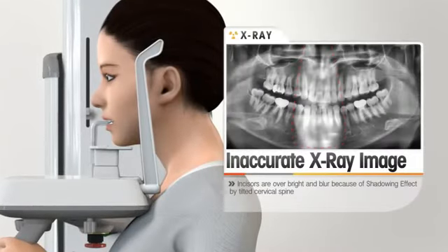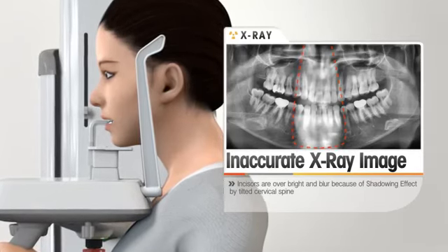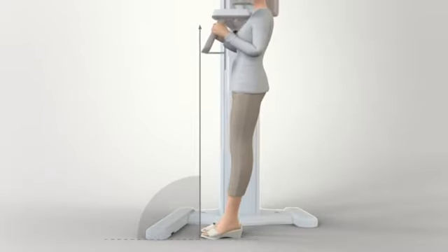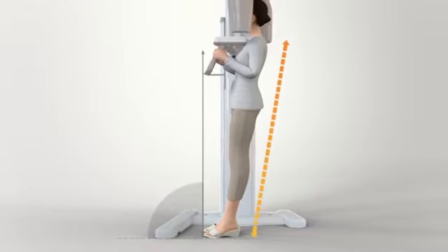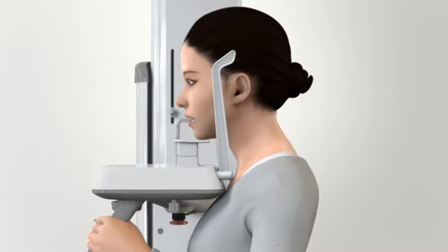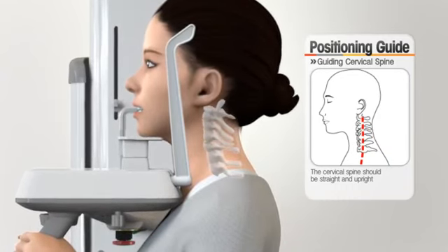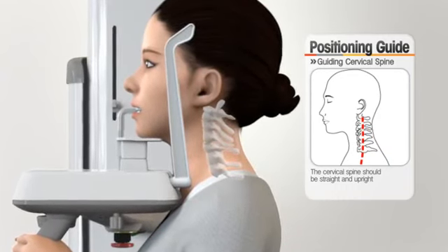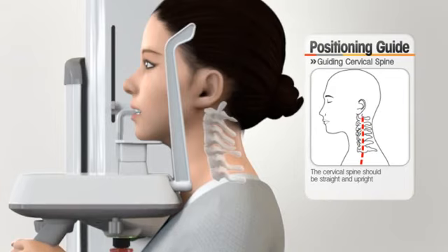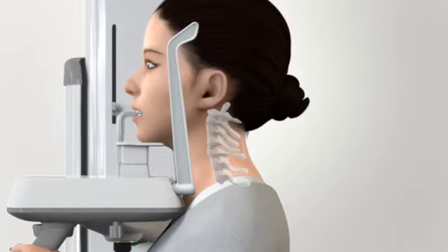The operator should position the patient according to the following process to minimize the shadowing effect of the spine and stretch the spinal image. Ask the patient to step forward like the screen. Bring the patient's chest close to the handle frame. Using the up-down switch, raise the chin support so that the patient's spine can be properly stretched. Before pressing the up-down switch, the operator should inform the patient about the movement of the chin rest and control the switch. At this time, the patient should be stretched up and the patient's face raised slightly.